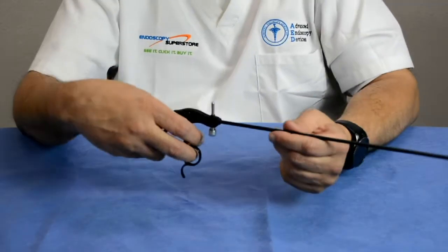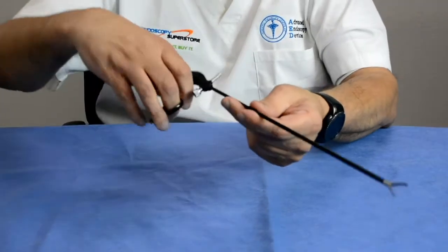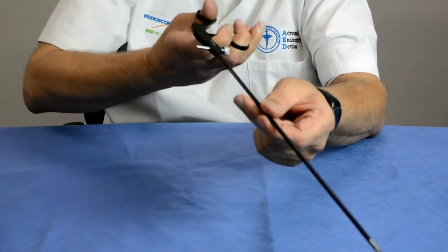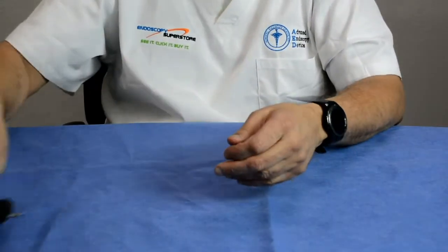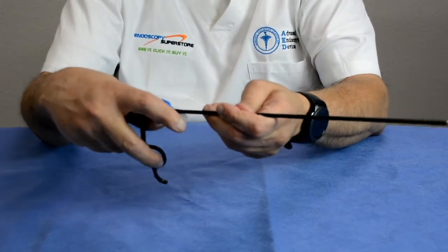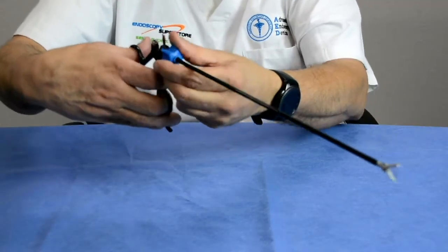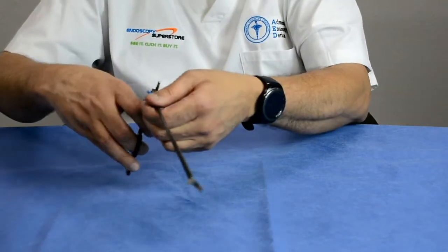As laparoscopic procedures developed and more were being done, doctors had a hard time manipulating the forceps inside the body. If they wanted the jaw at a different angle, they'd have to twist their hands. Depending on the patient's anatomy and size, this made it very difficult for some doctors. So the next evolution of laparoscopic forceps introduced a rotatable shaft — you could open the jaws, rotate the shaft, and get the jaws into the right position to grasp, cut, or dissect.